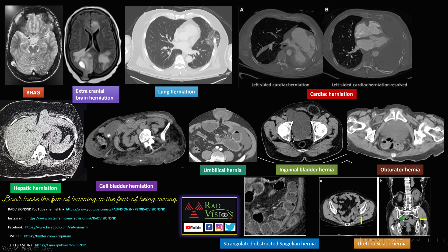These are the different spectrum of cases we have seen: brain herniation into arachnoid granulation, extracranial brain herniation, intercostal lung herniation, cardiac herniation onto the left side, hepatic herniation, gallbladder herniation, strangulated obstructed umbilical hernia, inguinal bladder hernia, obturator hernia, strangulated obstructed spigelian hernia, and uretero-sciatic hernia.